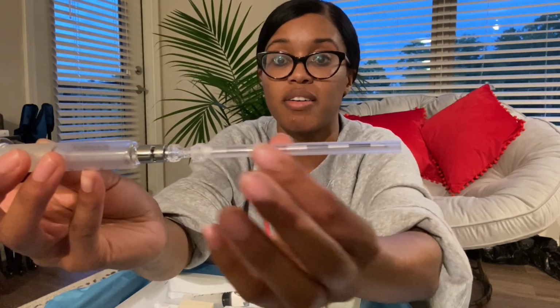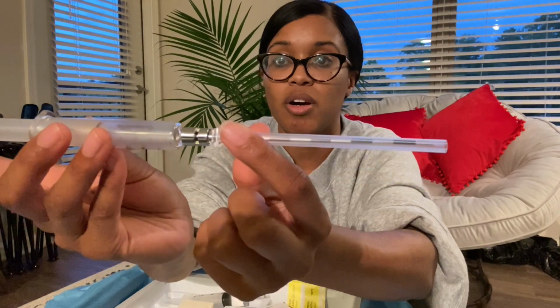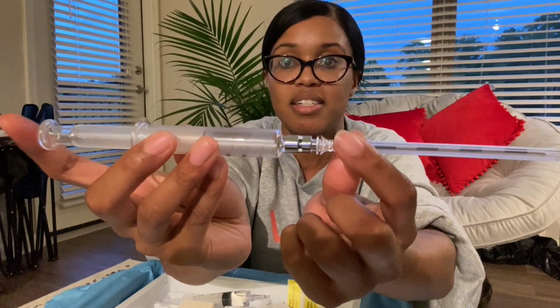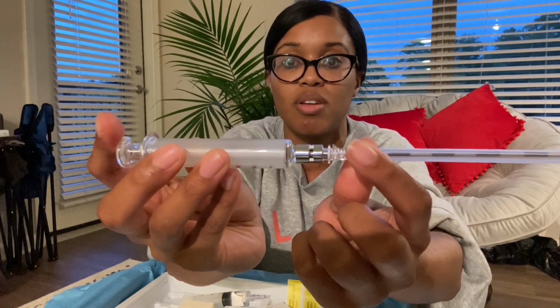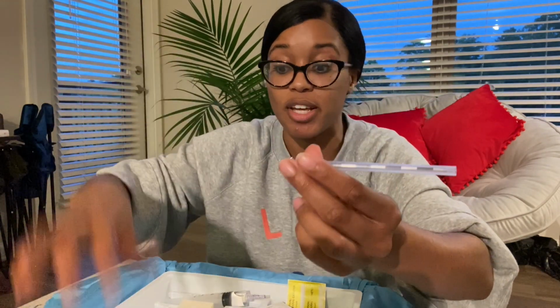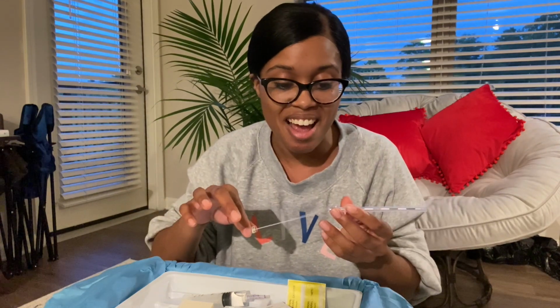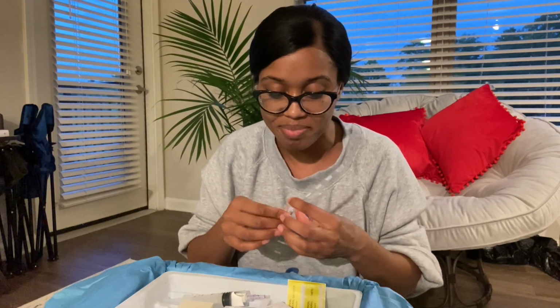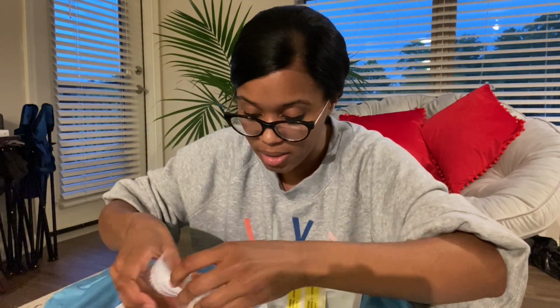Once we are going through the ligaments, we are testing for loss of resistance, and you keep going, inserting in, test, inserting in, test, inserting in, test. Then once you lose resistance, you should be in the epidural space, and that is when you disconnect this and can thread the catheter in. And if you can thread the catheter in pretty easily, you should be in the epidural space. But there's always a chance you're not, but usually you are.